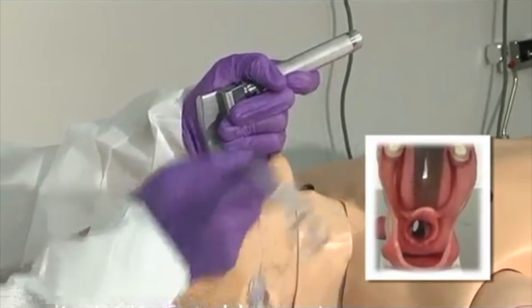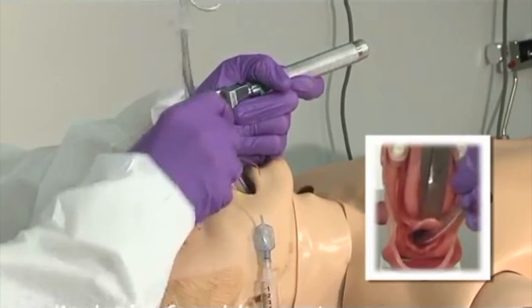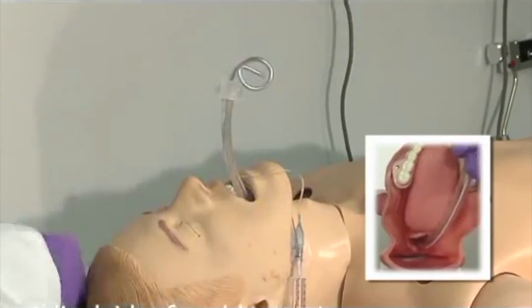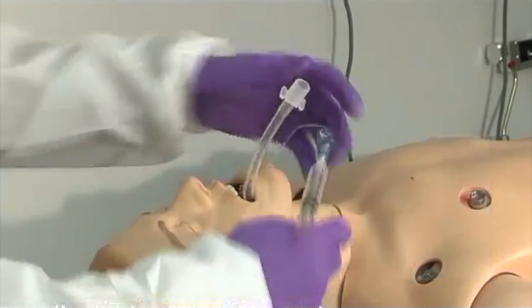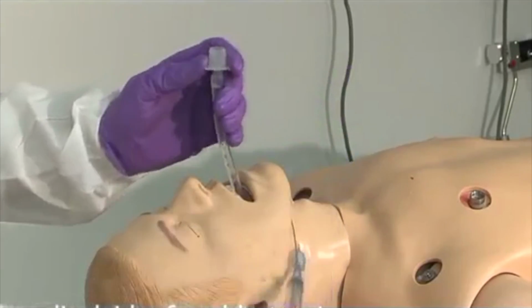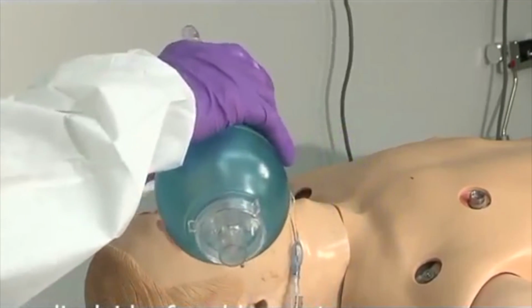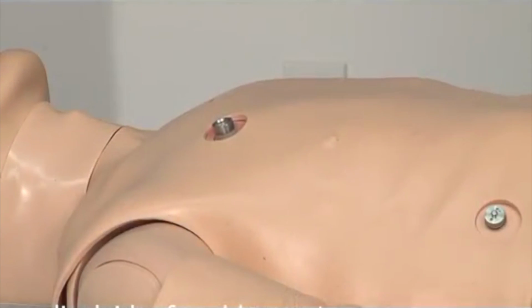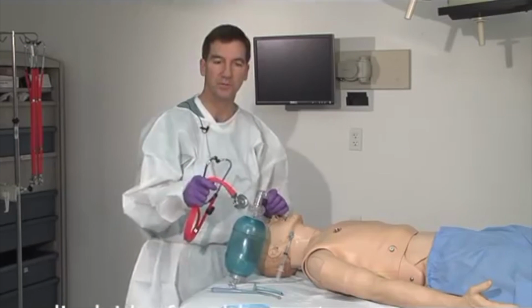Visualizing the cords, I place the tube and watch the cuff go inside the cords. Stylet comes out, cuff is inflated, and patient is ventilated. Watch for rise and fall of the chest, and then auscultate to hear breath sounds on each side with no borborygmi.